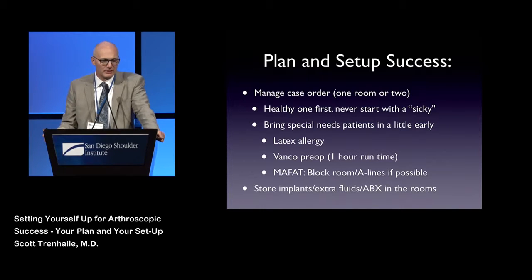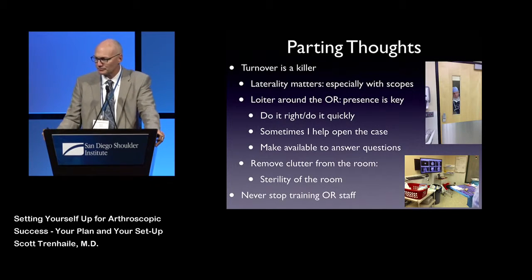The other thing is I like to store the implants in the room if possible, have extra fluids available, and also the IV antibiotics in the room so that when you go to do your timeout, there are no delays and people running all over trying to find things to get going.